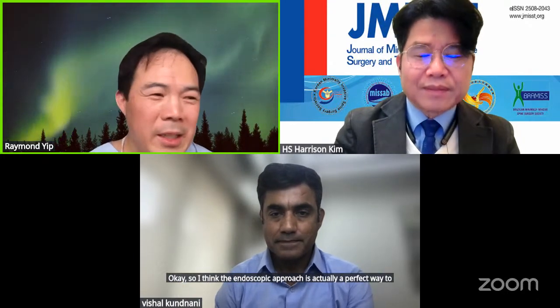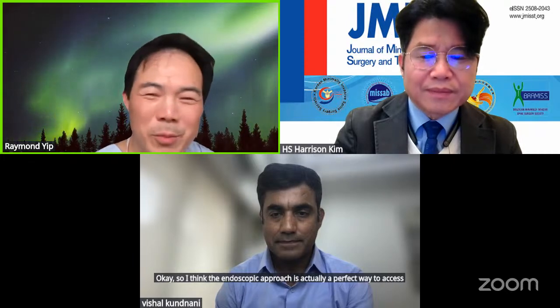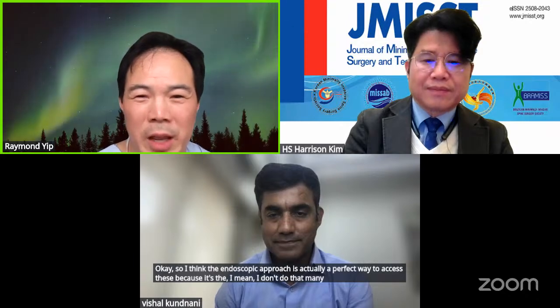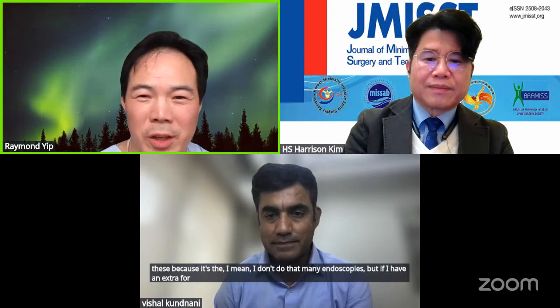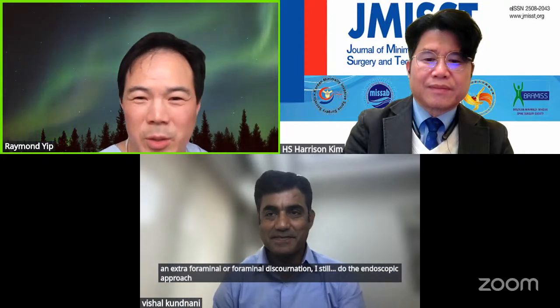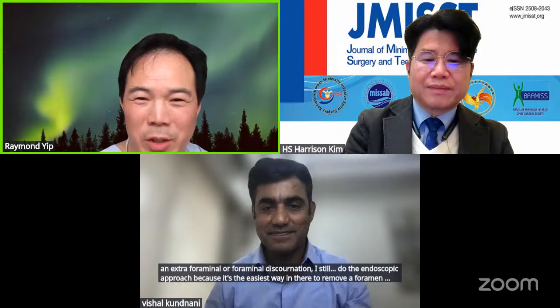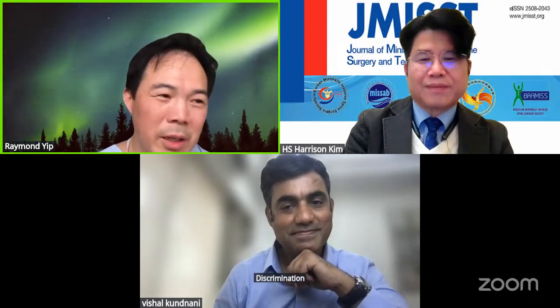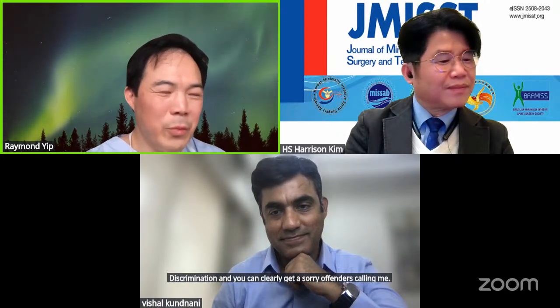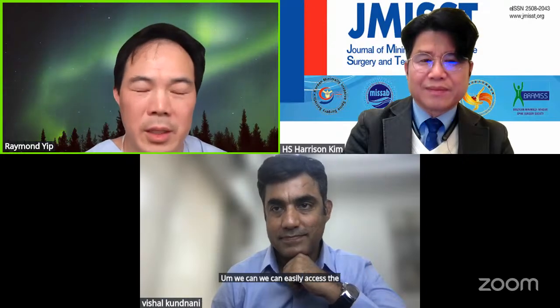Okay, so I think the endoscopic approach is actually the perfect way to access these. I don't do that many endoscopies, but if I have an extraforaminal or foraminal disc herniation, I still do the endoscopic approach because it's the easiest way in there to remove a foraminal disc herniation. We can access the foramen very easily from an endoscopic approach.